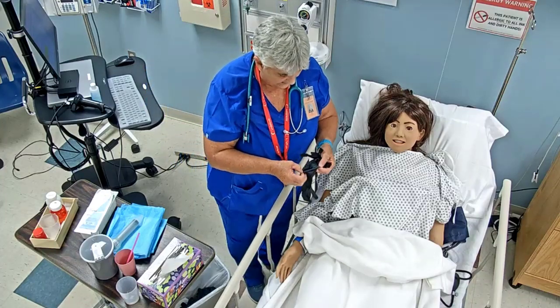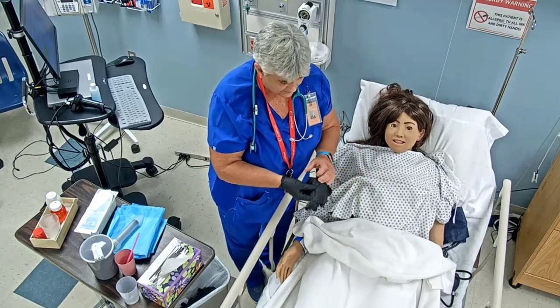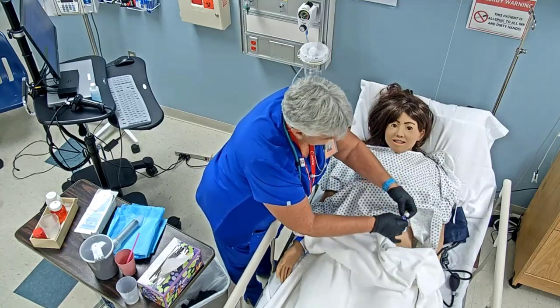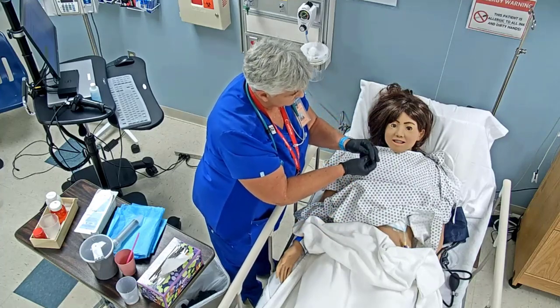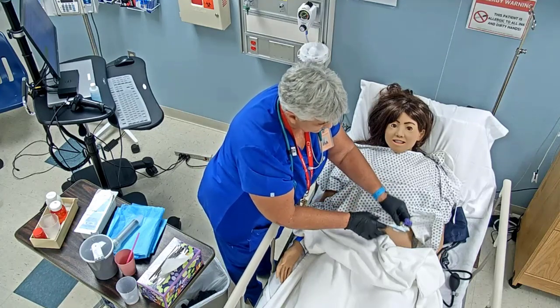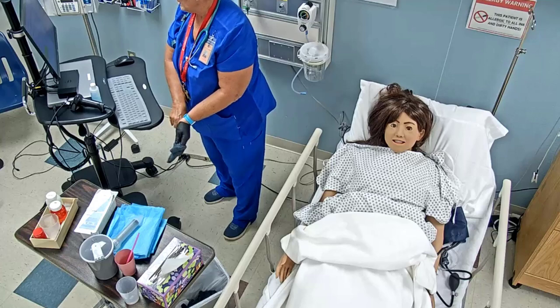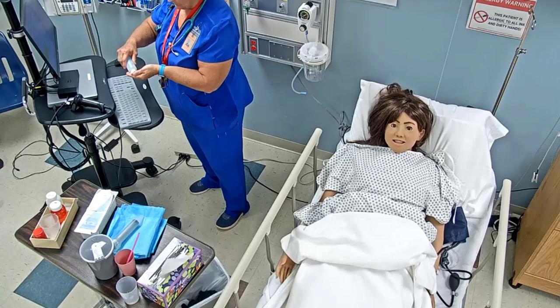If at this point we had the enteral feeding going through our PEG tube, we would go ahead and disconnect it here, and the tubing coming from the enteral, we would make sure we put a tip on it so it didn't get contaminated, and then we would make sure we had that closed right there. Okay. All right. I'm going to take those off right now. Glove to glove, skin to skin. And I'll do my hand wash again.